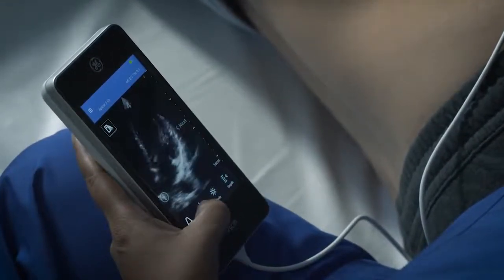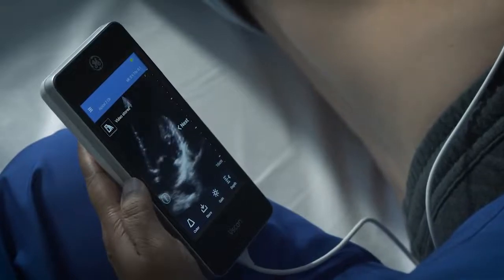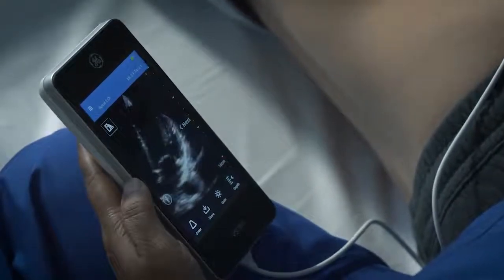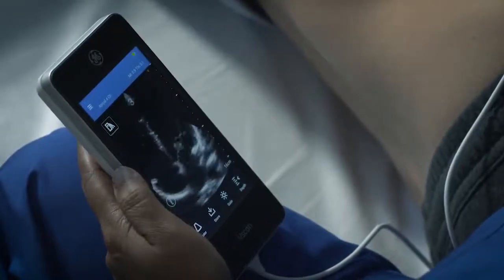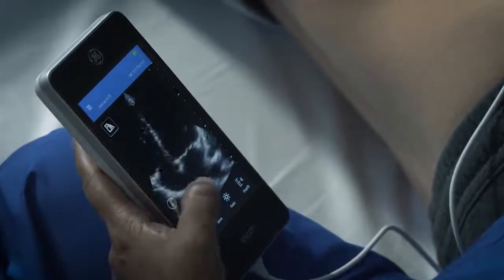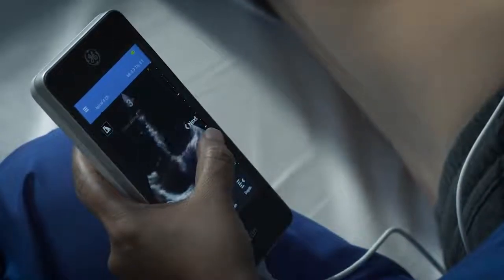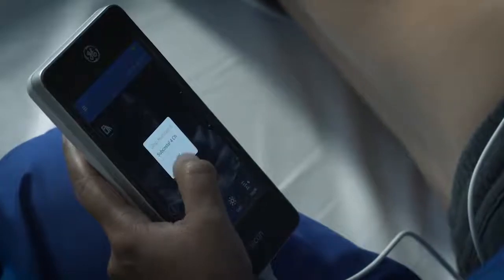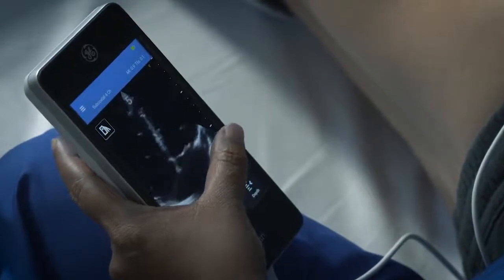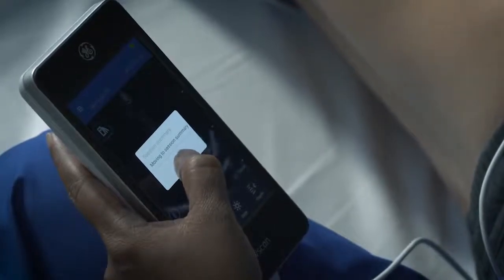Note that you can obtain multiple images for a single step and are not limited to one image. You will have the ability to swipe right to go to previous steps if needed. Once the protocol steps are complete, you will have the ability to move to the session summary. Select OK.